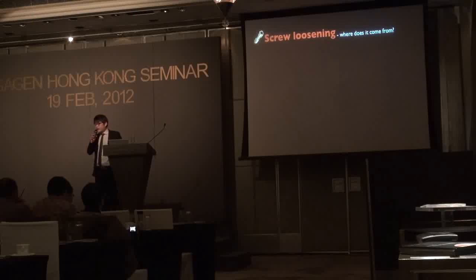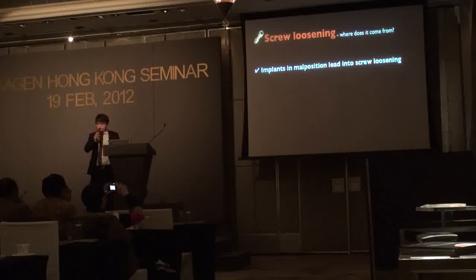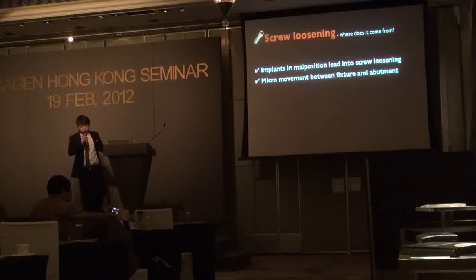According to many articles, implant malposition normally leads to screw loosening. Yes, definitely. Micro movement between the fixture and the abutment will lead to screw loosening too.